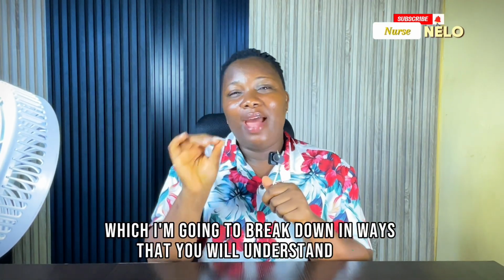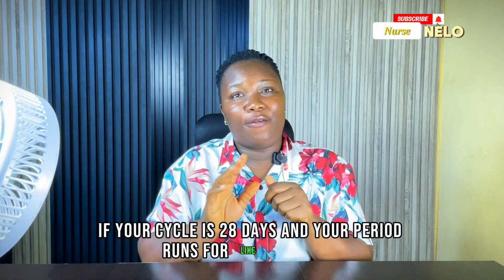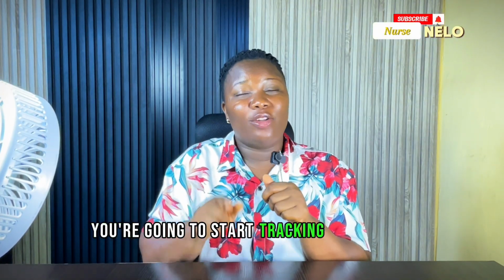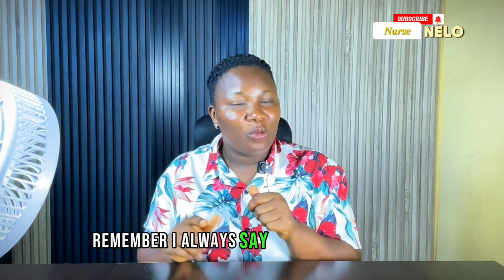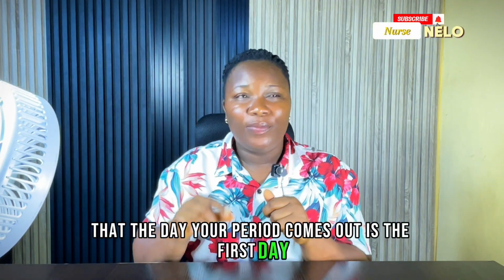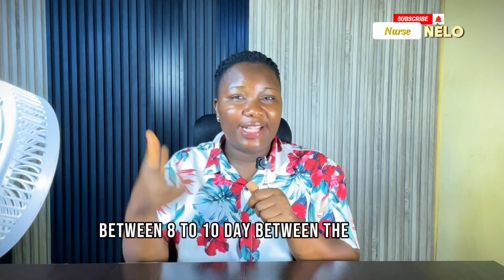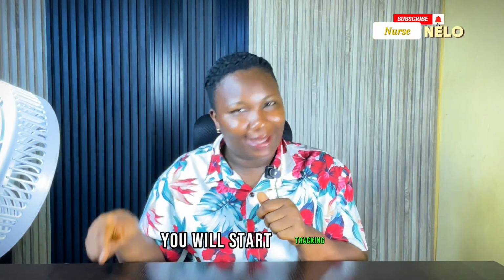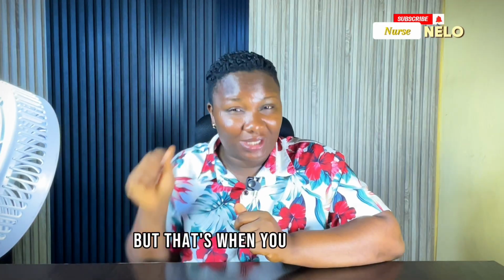Now, if your cycle is 28 days and your period runs for like 4 days, you're going to start tracking on the 8th to 10th day of your cycle. Remember, I always say, which is universal, that the day your period comes out is the first day. So if your period stops on the 4th day, you will count 5, 6, 7, 8. Between the 8th to the 10th day, you start tracking. You may not really get your positive result on that first day, but that's when you will start.